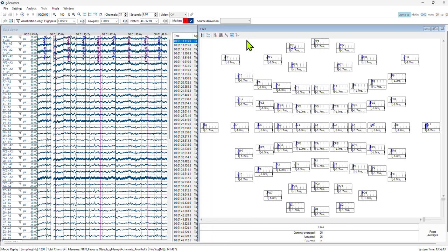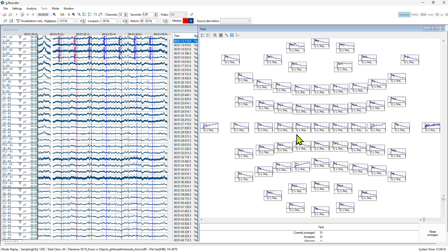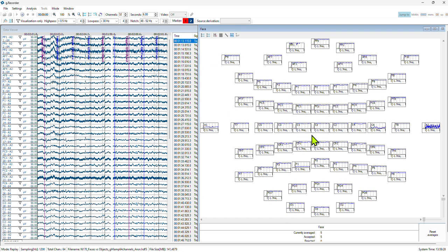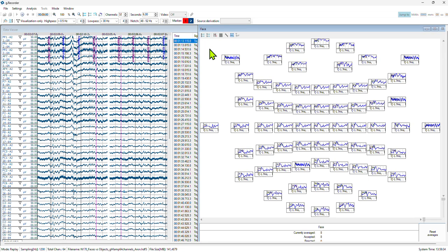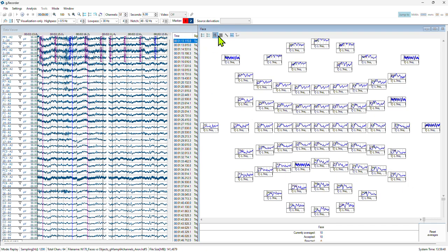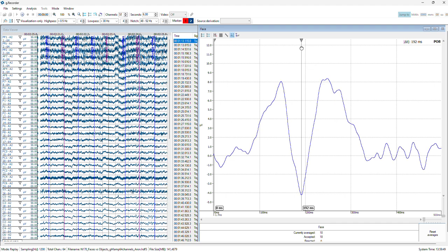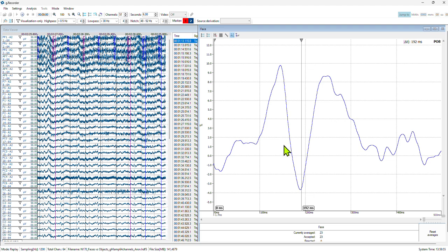So over here we are seeing we're having already some 30 trials. If it looks like that, you can reset it, so it will just affect the visualization. So if you have in the beginning probably one very noisy trial, and then you can see we are obviously getting the N170. So let's go to the P8, PO8 for instance, and check it out, and see we have a nice one. This one is easy to get. It's child's play compared to the TMS.